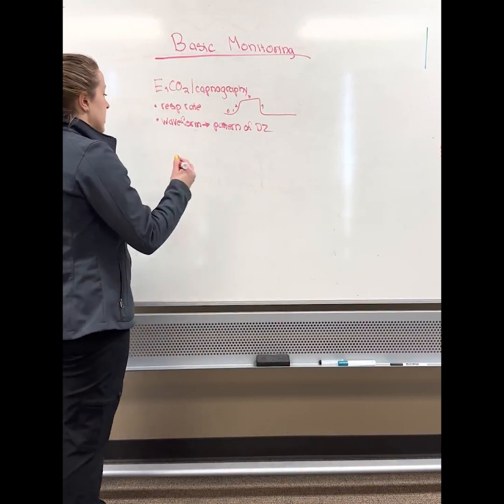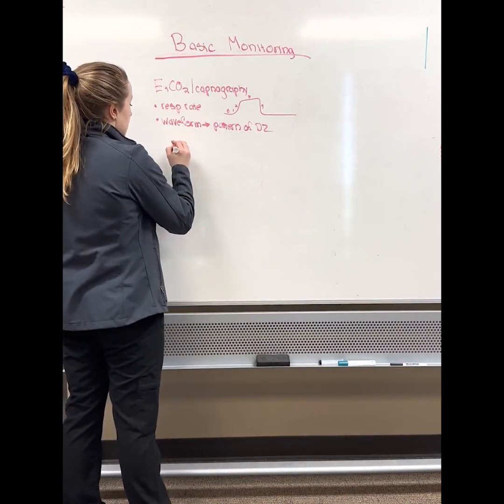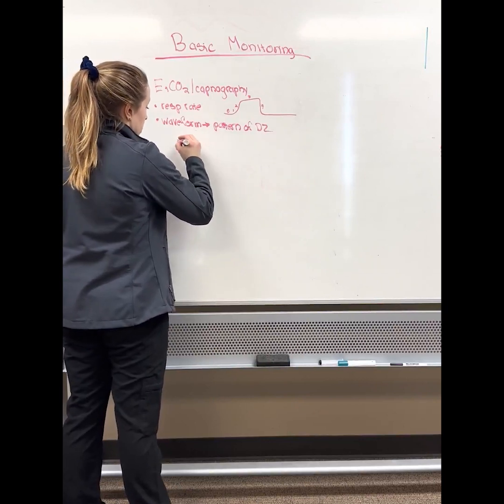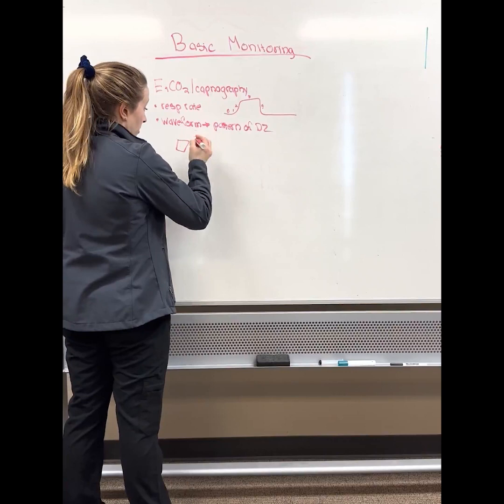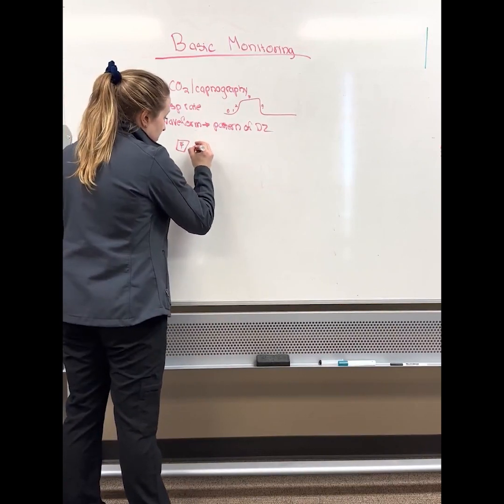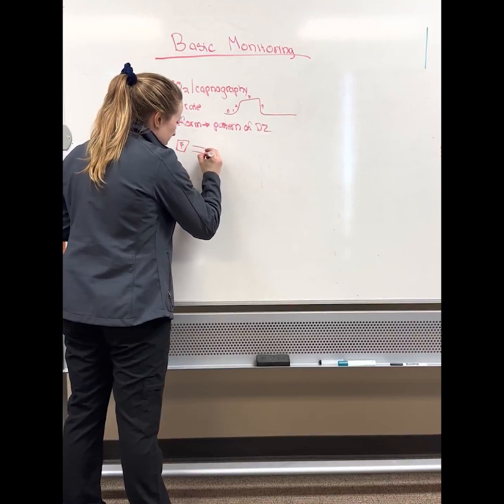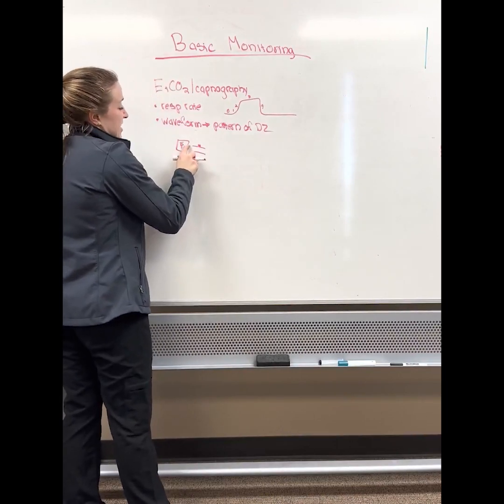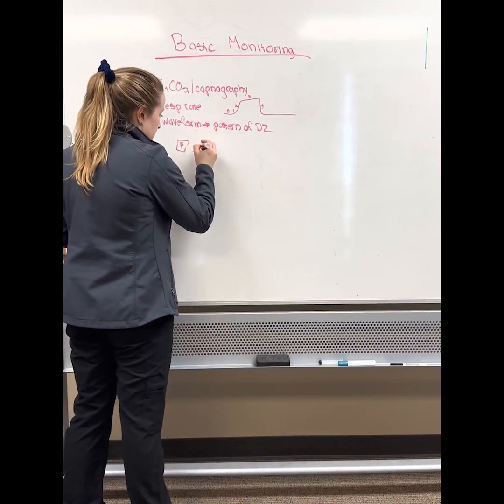So basically what is going to happen in terms of its measurement is that, let's say you have a dog over here. I'm not going to draw a dog. I'm going to draw a square because my drawing would be an abomination. So let's say you have your patient here, and they're connected to a CO2 unit, which I'm going to draw as something quite familiar. It attaches to the patient's breathing tube, the endotracheal tube.